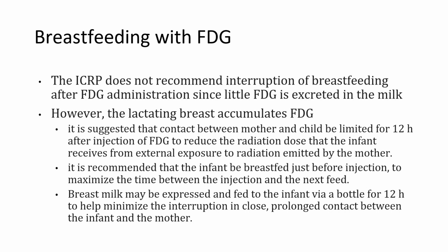However, lactating breast does accumulate FDG, and so the problem with that is if the mom is holding the baby and the baby's eating, then that baby is really close to the radiation exposure because that mother is extremely radioactive.